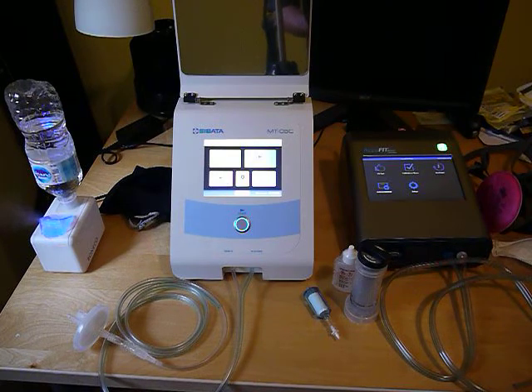Even the time of year can be a challenge. In the summer when it's very humid, we generally have more issues with fit testing. July and August can be tough months to do fit testing.